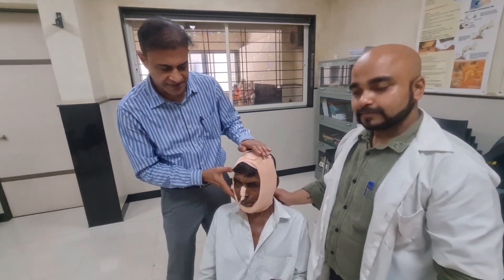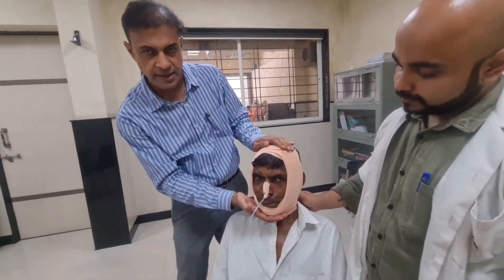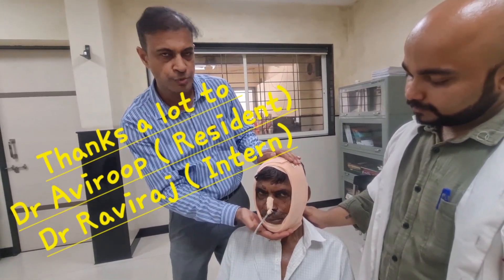The advantage of the Barton's bandage is that it gives pressure on the mandible, while at the same time the patient is able to speak and eat from his mouth with limited mouth opening.